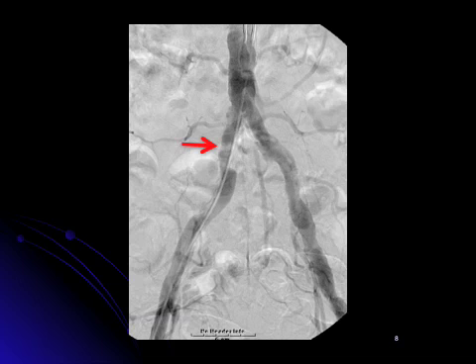At this point, the surgeon and I discussed this, and he requested that we stent that right common iliac artery lesion with an attempt to provide better flow down the right leg prior to his bypass graft. We then punctured the right groin, put a guide wire up into the aorta, and provided you with these pictures.